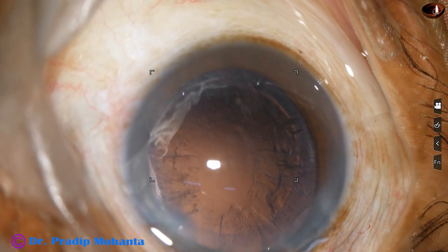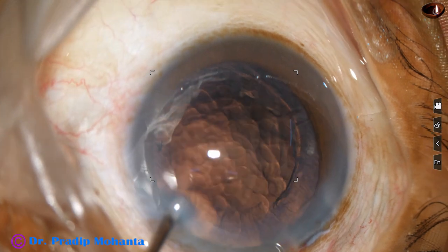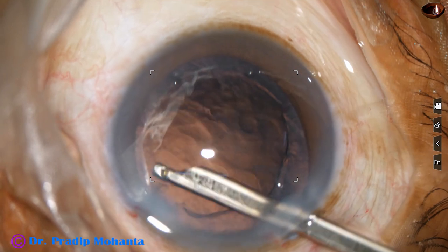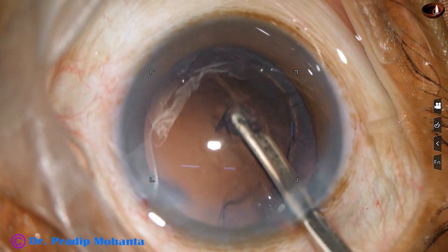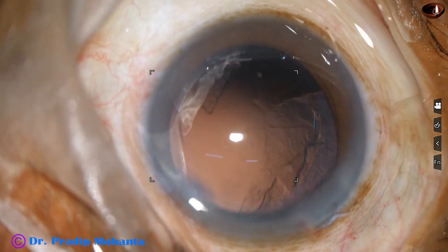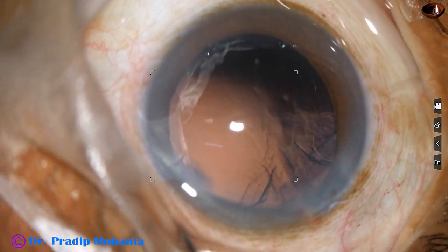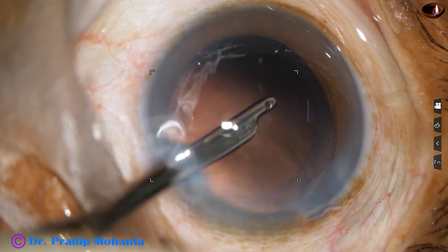Now cortical cleanup is to be done. I'm going to use a 23 gauge Simcoe cannula to remove this cortex. See how beautifully it comes. Go through the side port to remove the subincisional cortex.